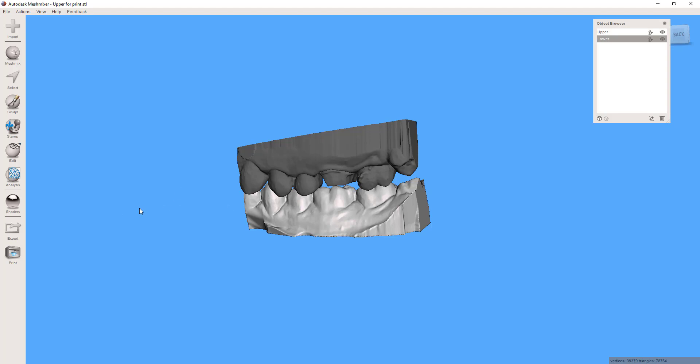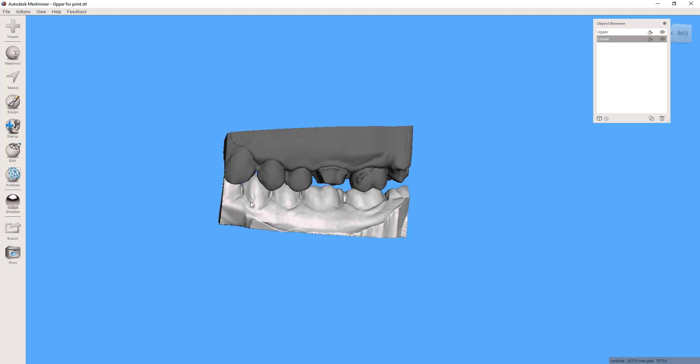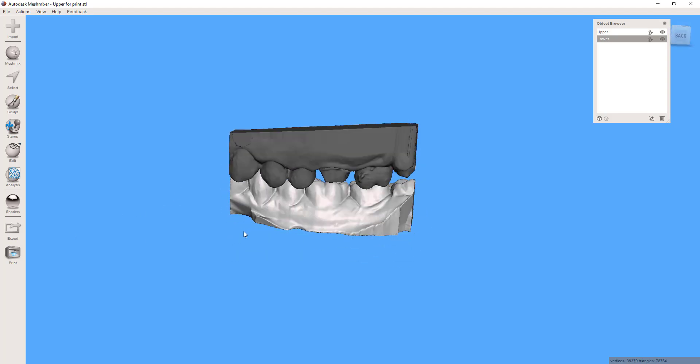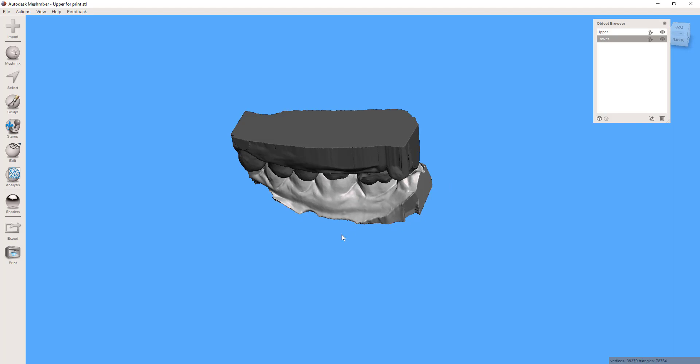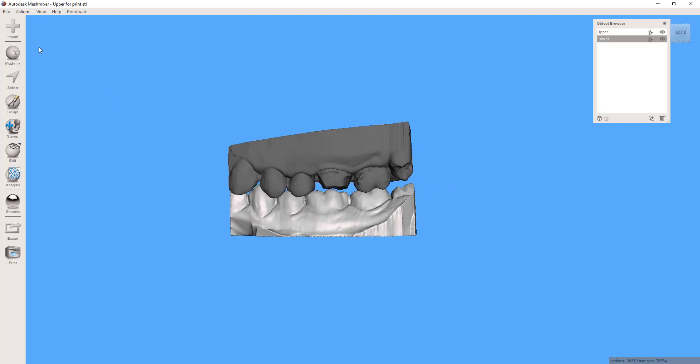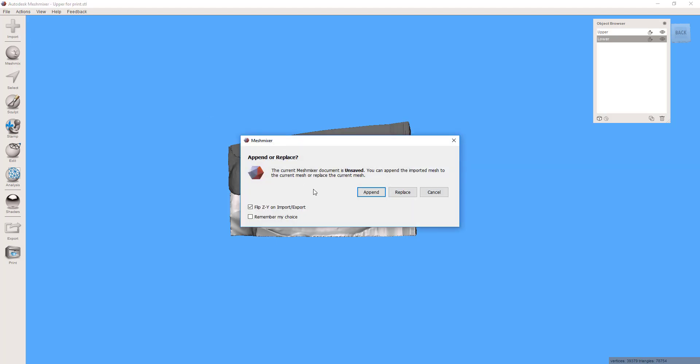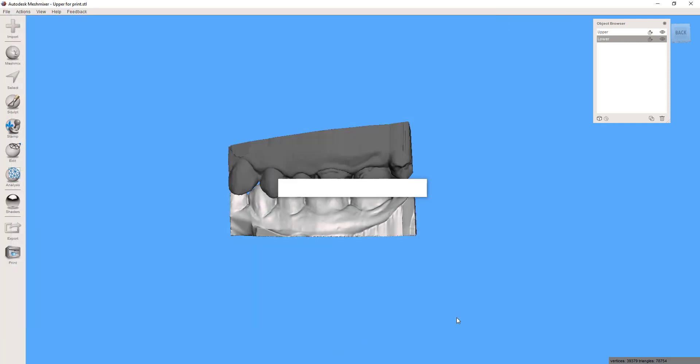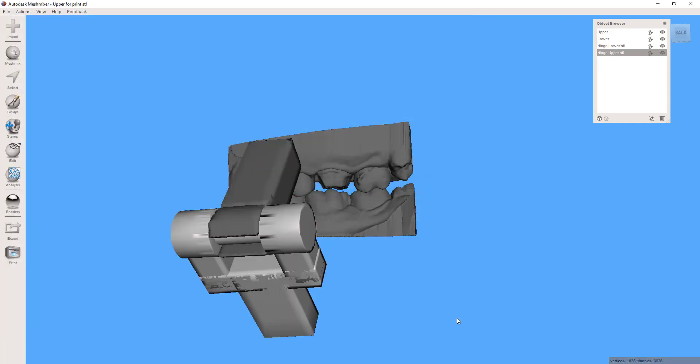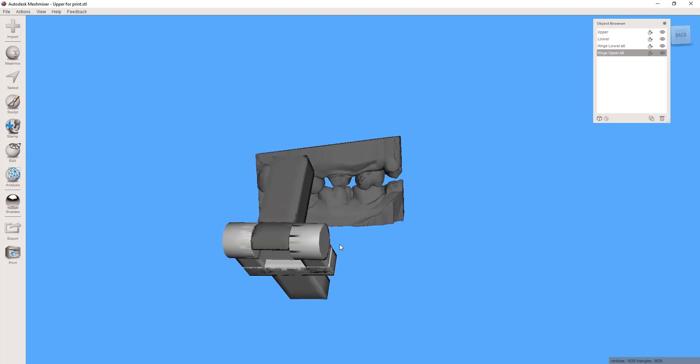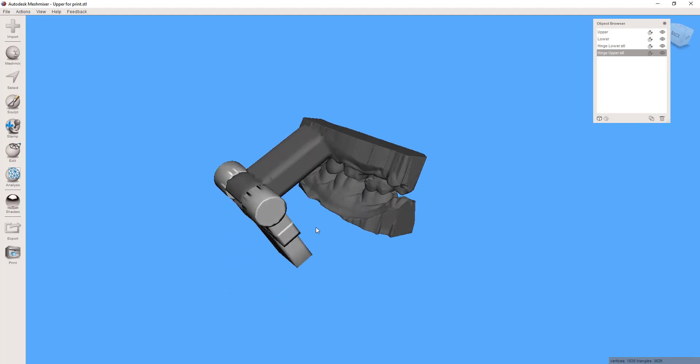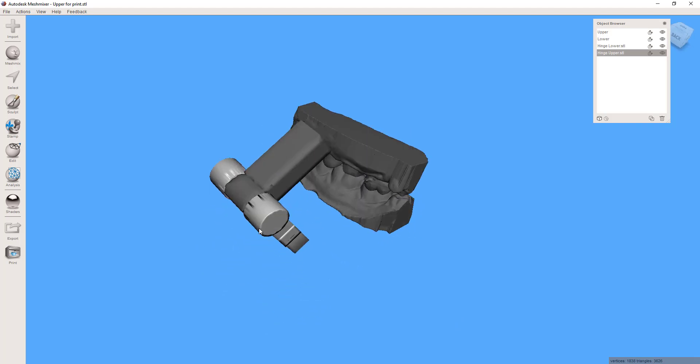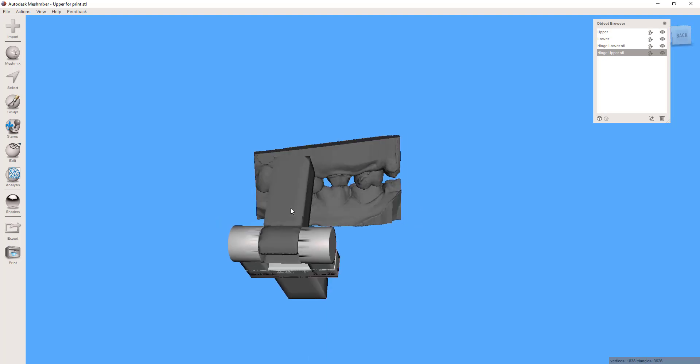What you'll need to do is open up your upper and lower model. They should be completely enclosed, solid objects, and then you'll need to import the upper and lower portions of the hinge. Control select both items and then open. It will pull those into the project but these are obviously not oriented yet to the models, so what we're going to need to do is position those into the models.